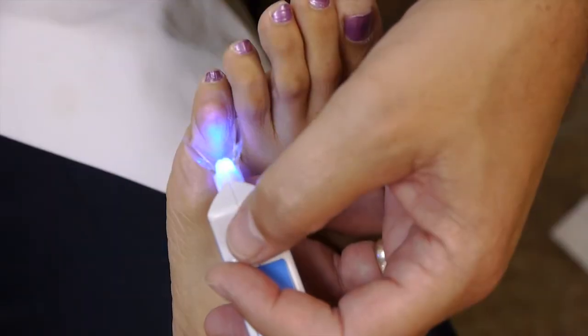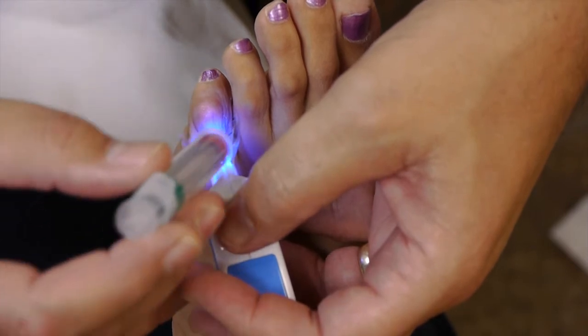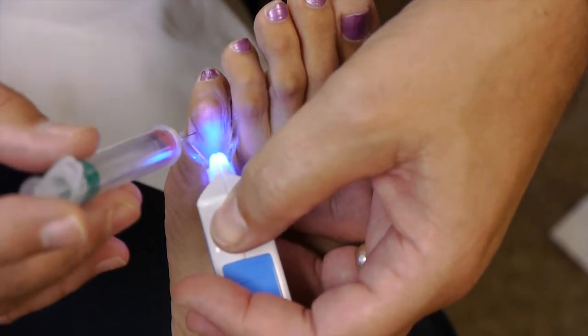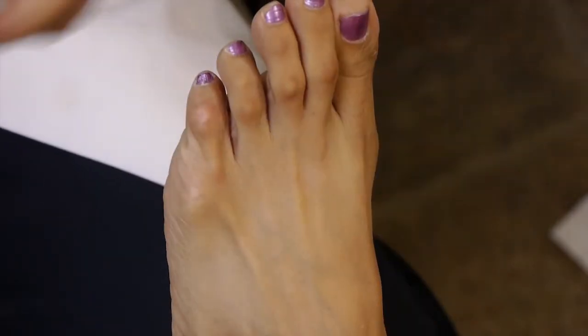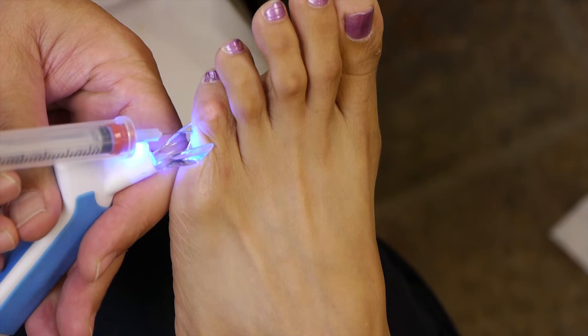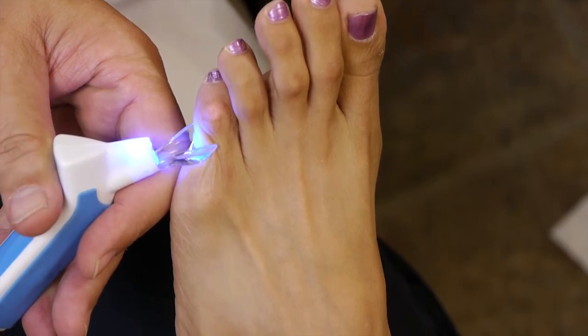When I do a fifth toe, I put the device directly on the base of the toe, and I inject dorsal medial and dorsal lateral. I can also hold the device like this and infiltrate directly on the plantar aspect of the toe, just like that. And they don't feel it.